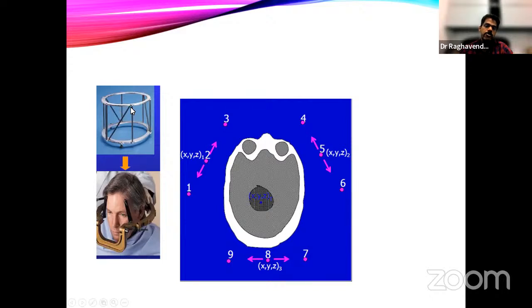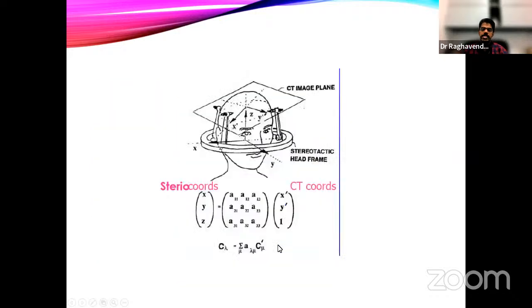That means if you scan from the cranial side, these 2 points merge. When you come towards the caudal side, these 2 points are quite far away from each other, and that one merges with this point. So this is how you see them in the CT scan. Like this, we have it from one side of the patient across the entire skull.